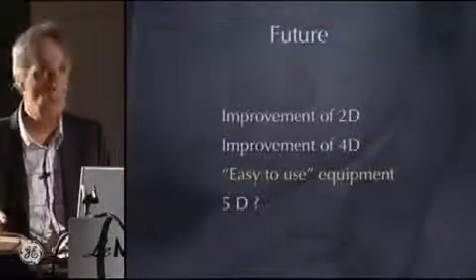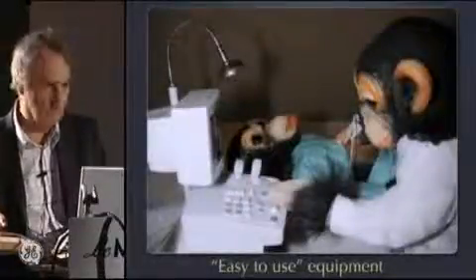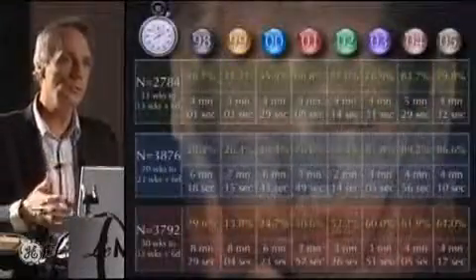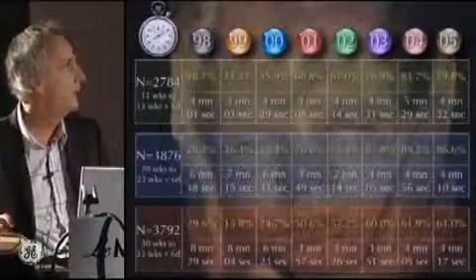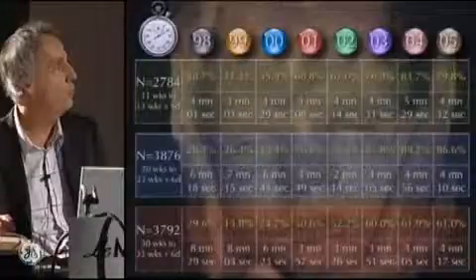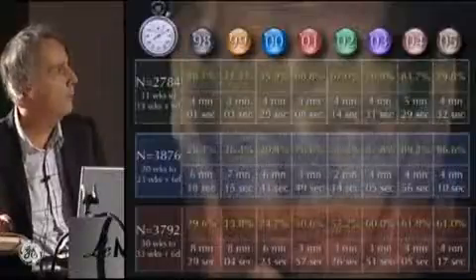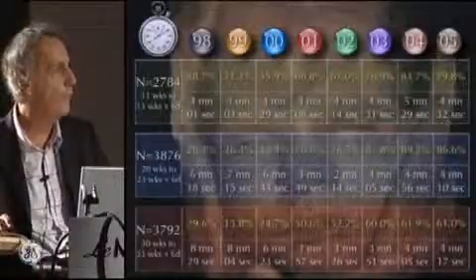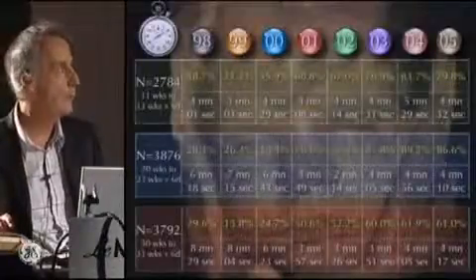What we need also, we need an easy-to-use equipment, like this one. And I always try to do, during my 2D screening examination, a picture of the baby using the 3D tool. And this is all over the year. My success rate to obtain a 3D picture in the first trimester, second trimester, and third trimester. And you can see now I am around 90% of success to obtain the face of the baby or the complete fetus in the first trimester during my 2D examination.